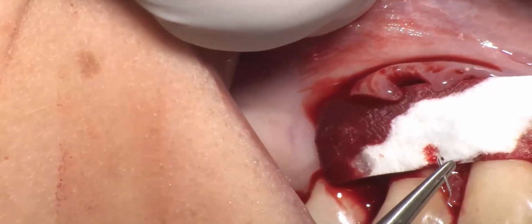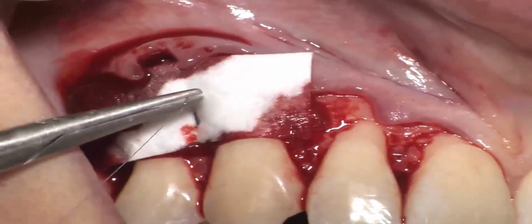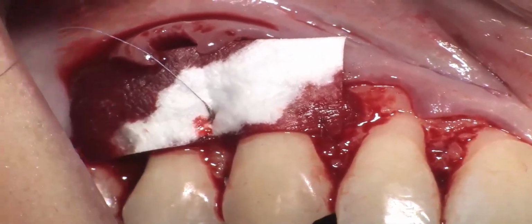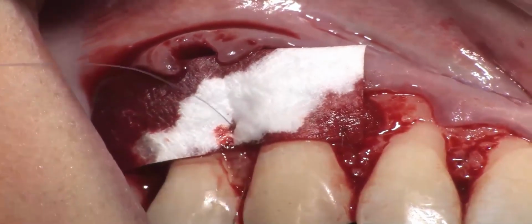I have to make the second suturing of this material at the base of the second papilla.